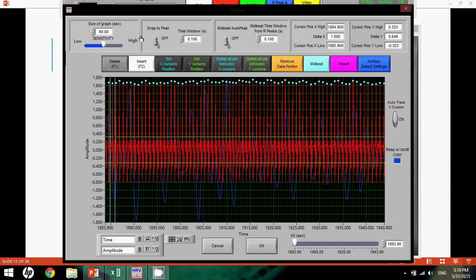On my particular keyboard, it doesn't work, but typically these are the buttons that I use when I do research or when I do these editing processes. So you'll click on F1 and F2. Again, it'll be important for you to get used to those keyboard functions, as it'll make the process much, much quicker when you're actually doing the work.